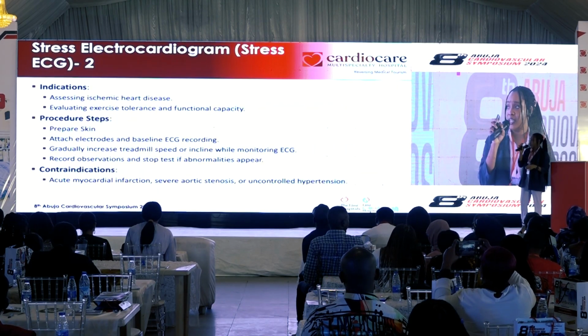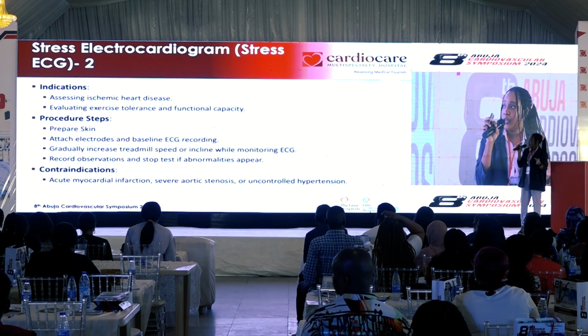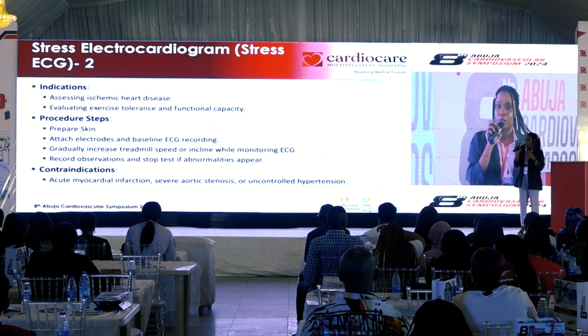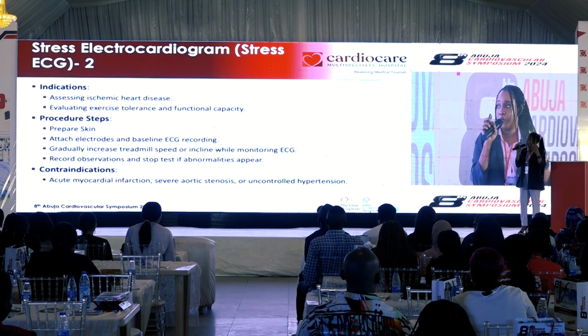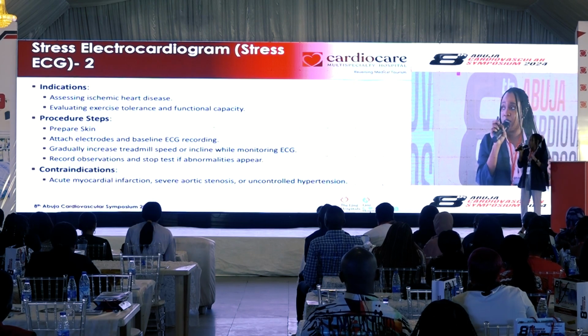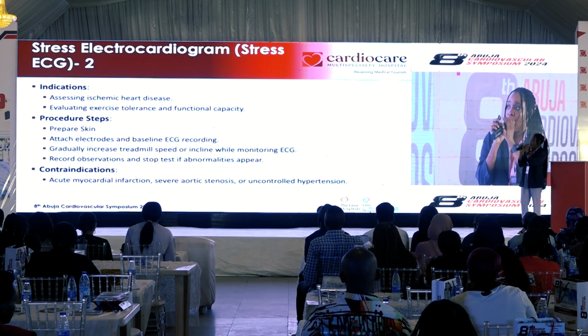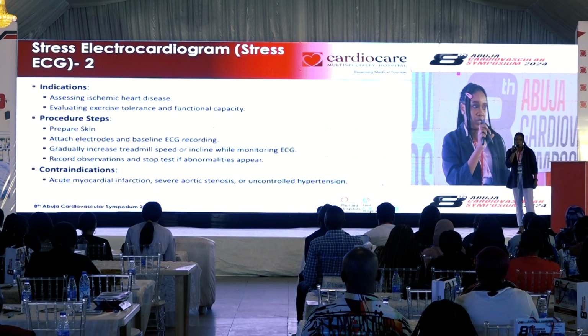Some of the indications are assessing ischemic heart disease, evaluating exercise tolerance and functional capacity. Some people will come in and say, I don't know if I can tolerate some kind of exercise. So we put them on this, we monitor their heart rate and see if they can cope with some type of stress.